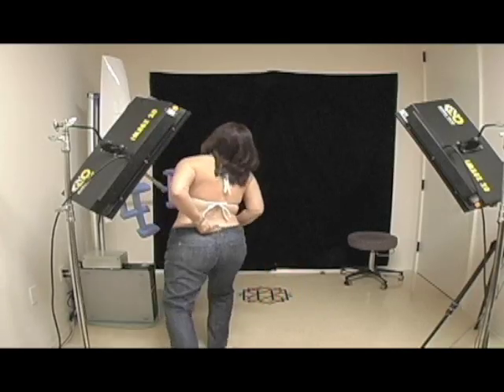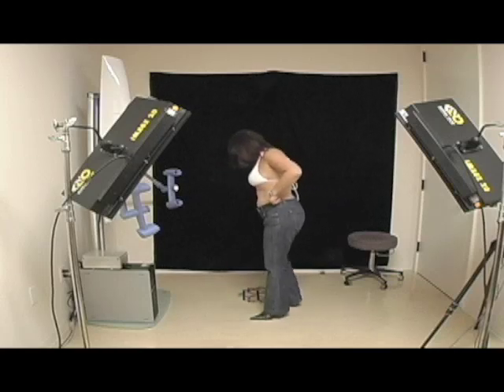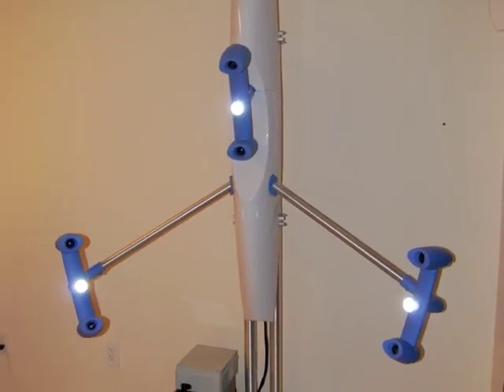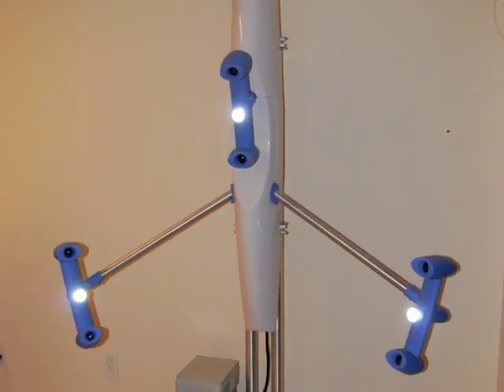The first step is to stand in front of the camera. The camera consists of three heads. Each of the heads has a white light, a very high resolution, medical grade, digital camera, and a projector. Each of the projectors shines a series of colored lines on your body. By acquiring images of the colored lines from different directions, the computer can determine the contour of your body and reconstruct that image.